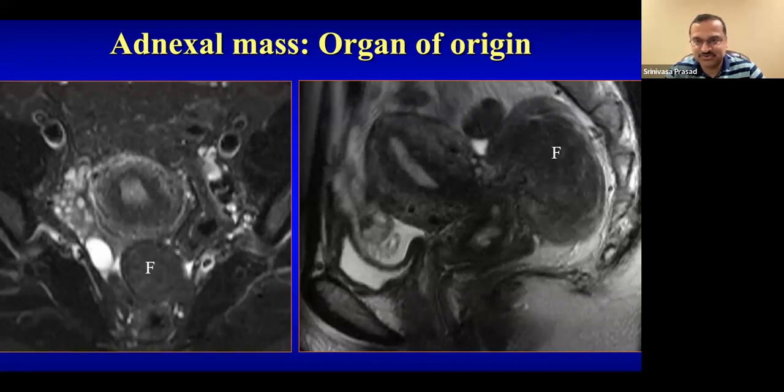And in addition to finding the obvious connection with the various organs, including you may find an exophytic gastrointestinal stromal tumor arising from one of the small bowel segments within the pelvis, or uterine leiomyoma. So it's important to identify a particular organ of origin, which helps us with the differential diagnosis.